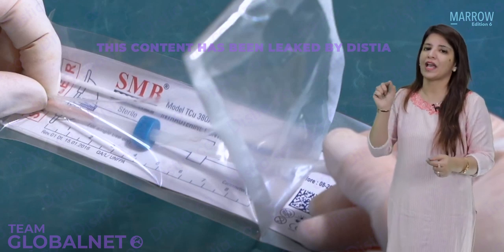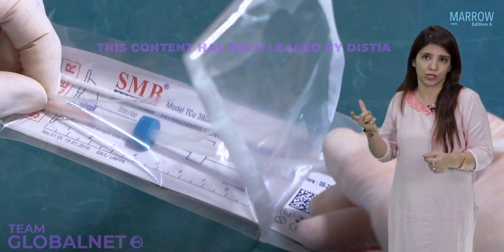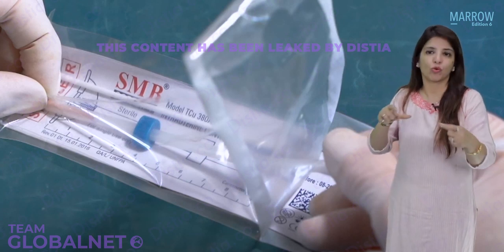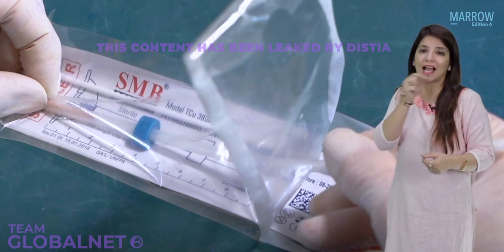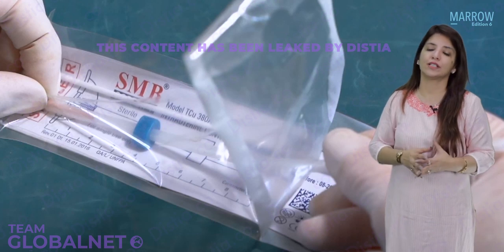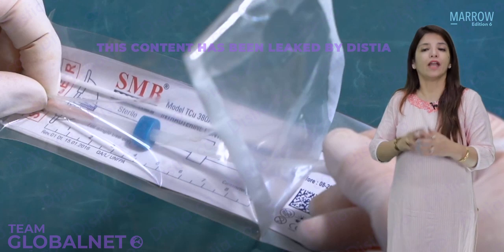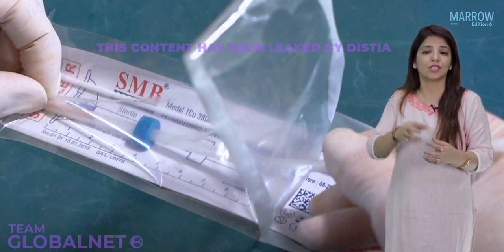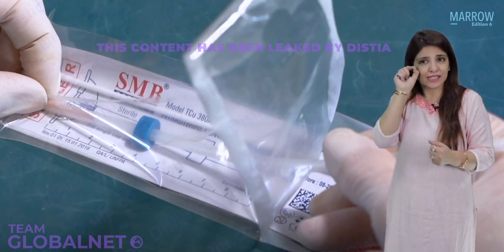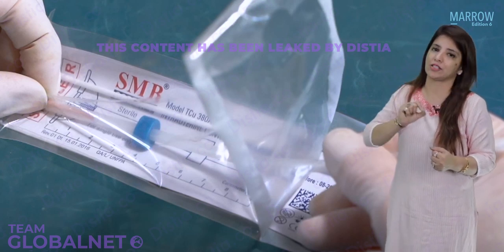So for that we have this blue colored gauge, which is also called the flange. Now, on the white colored sheet there, which is calibrated and has markings, suppose when I measured the length of the uterine cavity with the help of the uterine sound, it was 8 centimeters. The assistant is going to pull the loaded inserter back in such a manner that this blue colored flange lies at the 8 centimeter mark.